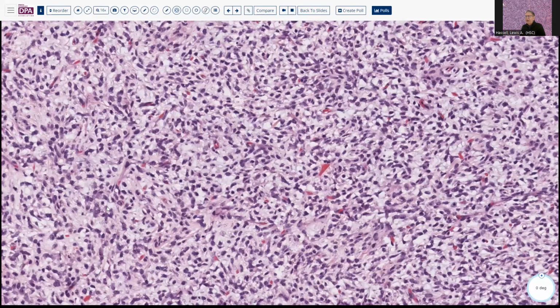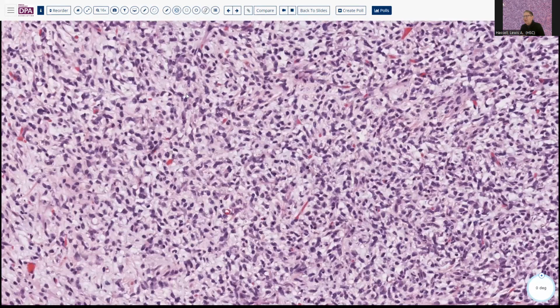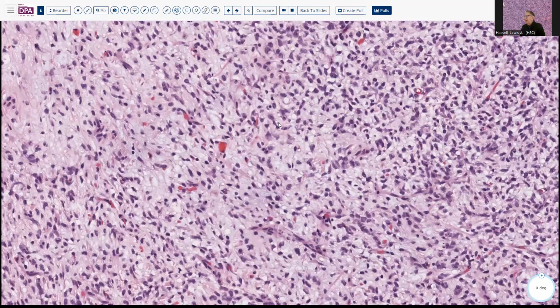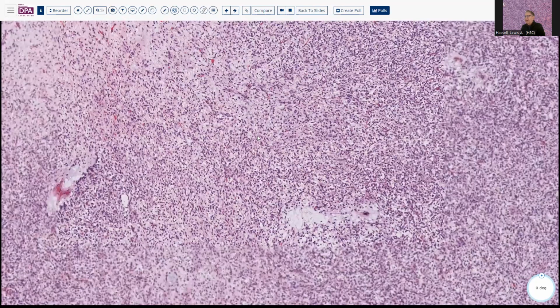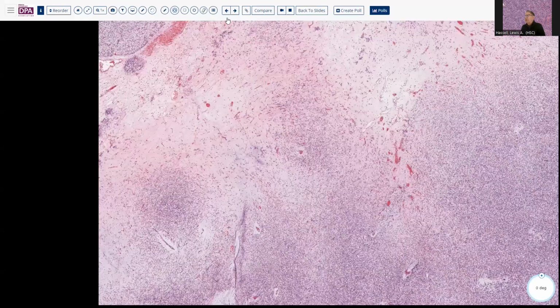And in fact, the cytogenetics in these two tumors, or two ends of the differentiation spectrum, are pretty similar. They have the same fusion gene and so would not be ideally classified under different headings. So this is not something that you immediately jump to saying, oh, that's liposarcoma, because there's very little lipo component to it. Let's see if we have another one here. I think we have one more.